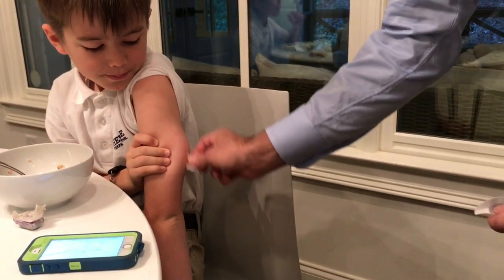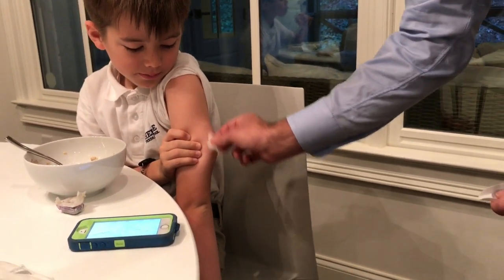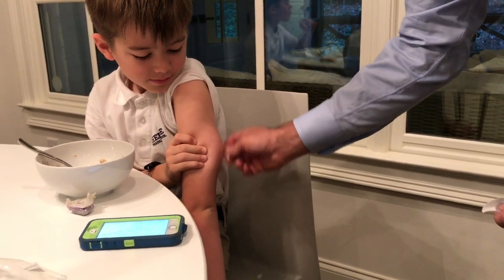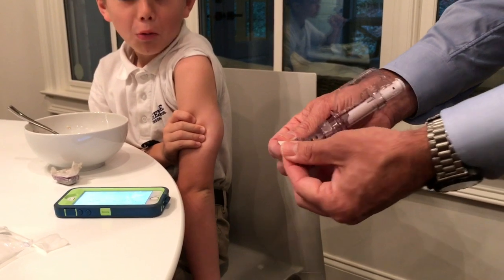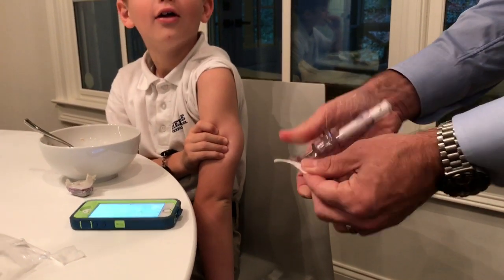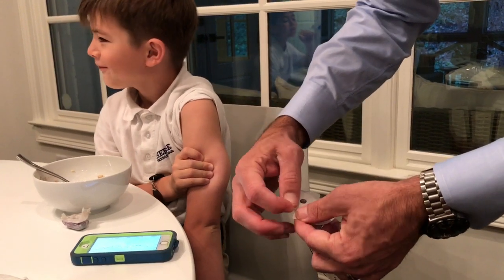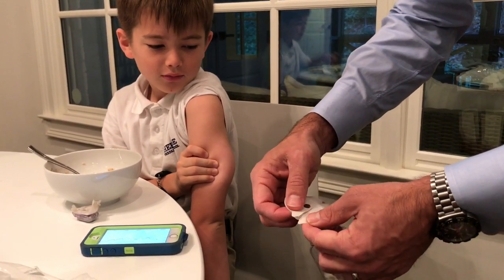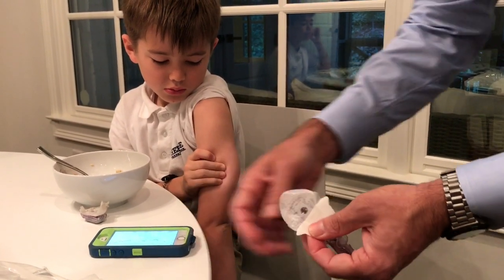I want to put it right in the middle of it — right there. Okay, there we go. Now I've got the sensor, so I'm going to make sure it's all flat and ready. These are easiest to partially pull back here, then partially pull back here — now you're good to go. Take the whole thing off.